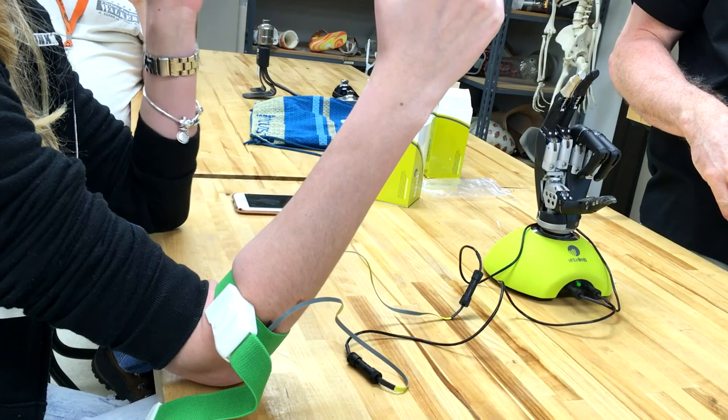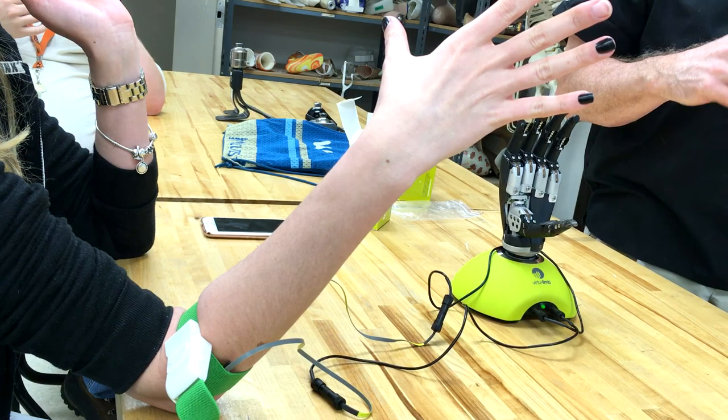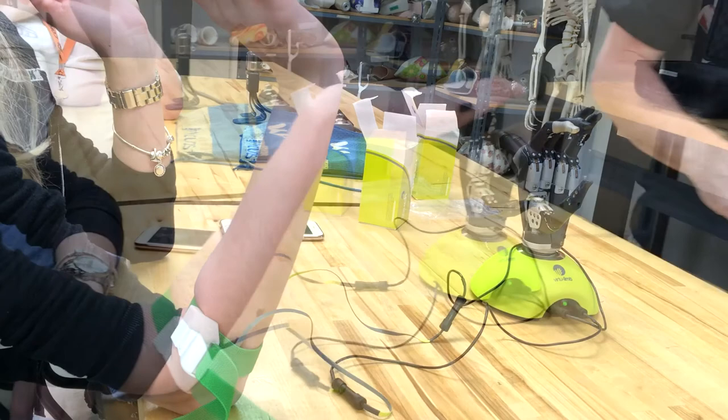So when that changes is when I have to do the flexion and extension? Yep, yep. So go ahead and flick it again, good. Now what I want you to do is flex so you have a different grip pattern and extend. Now you're using all the fingers.